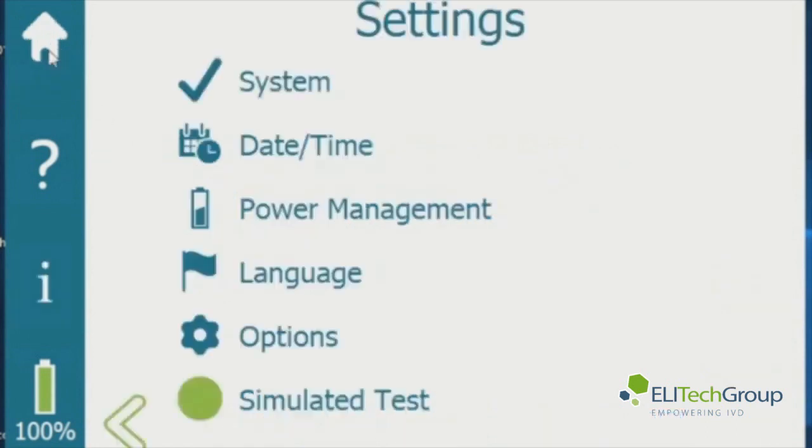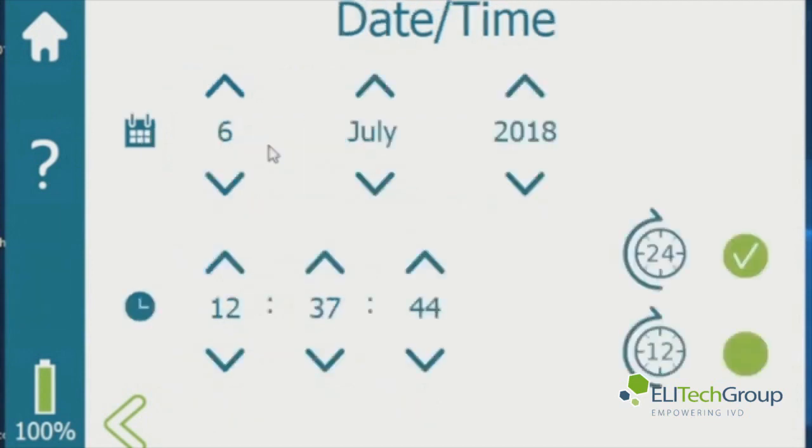Go back to the gear icon and you can go to the date and time. This will show you where you set the date and the time — you can set it for a 24-hour or a 12-hour clock. Hit the back arrow when done.